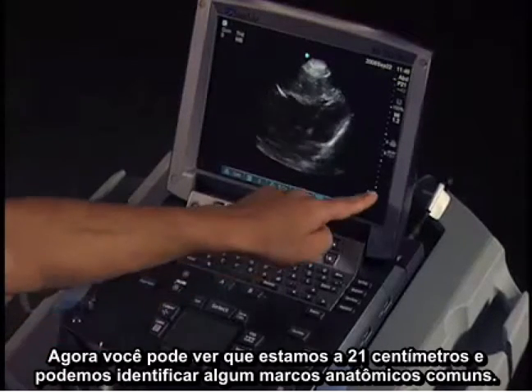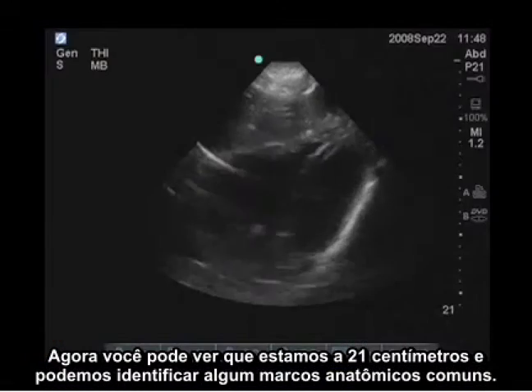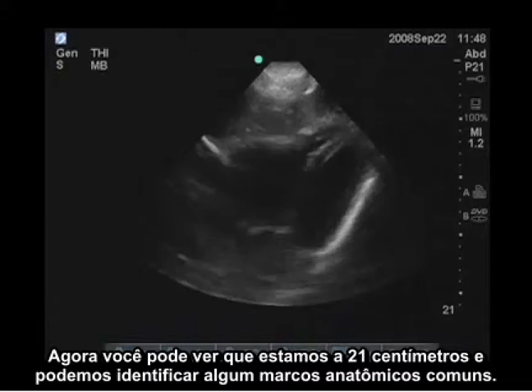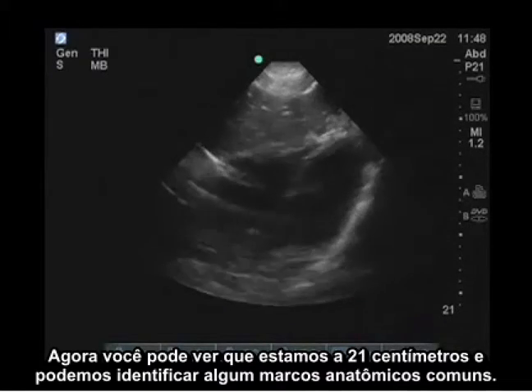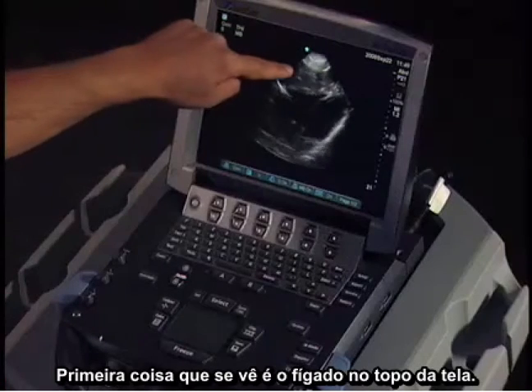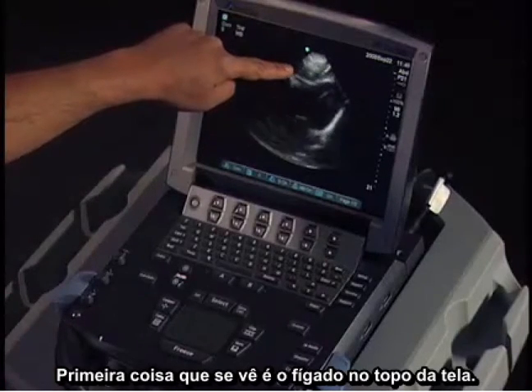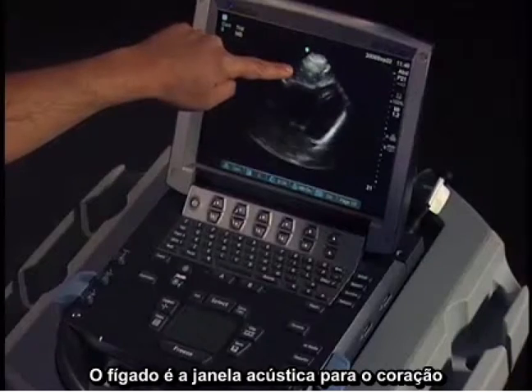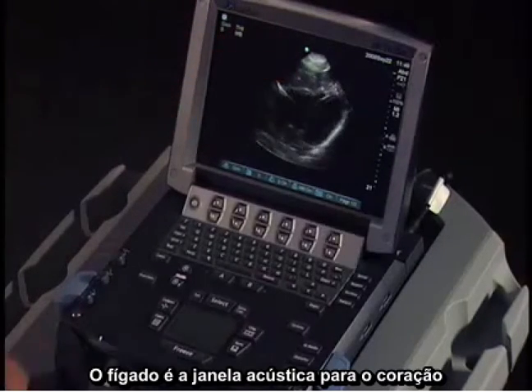Now you can see we're at 21 centimeters. Some common landmarks that you need to identify: the first thing you see is the liver at the top of the screen. That liver is our acoustic window into the heart.